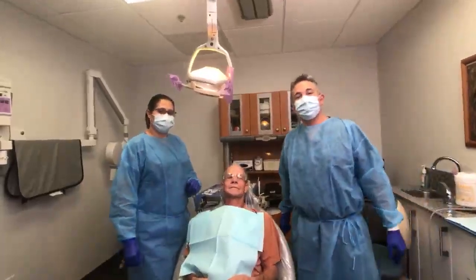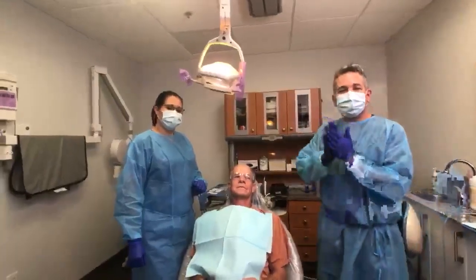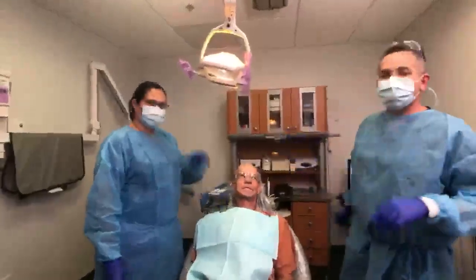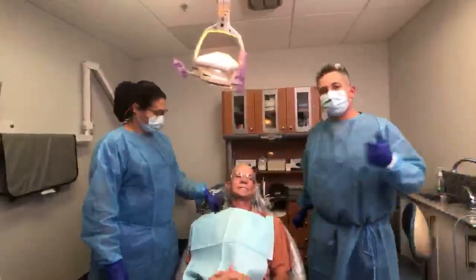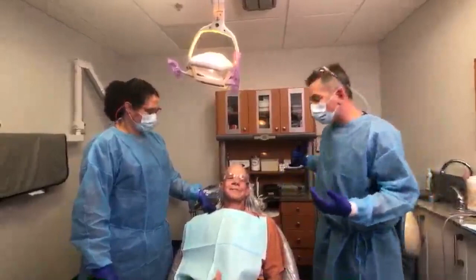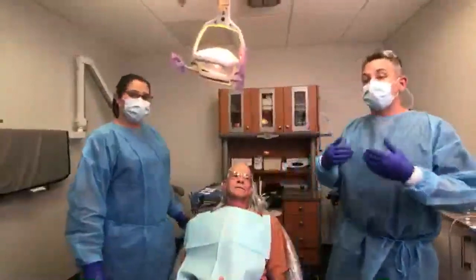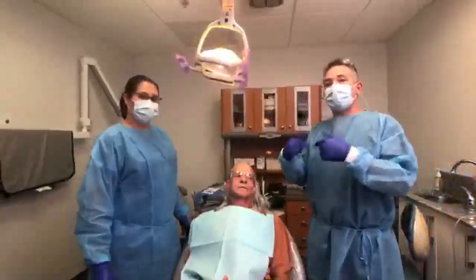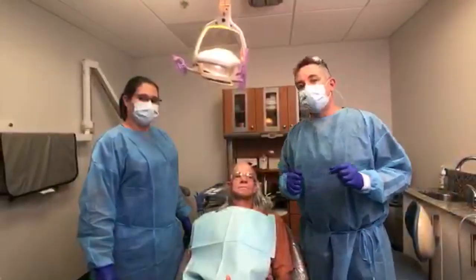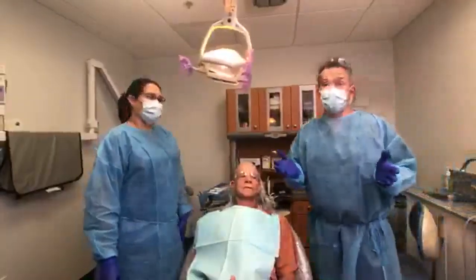We're coming live from Boynton Beach tonight to bring you an exciting event. We're going to do a single tooth dental implant on my buddy Zeke here. Our lovely film crew is joining us tonight. We're going to be doing a single tooth implant on a guy who's been our patient for a good number of years.